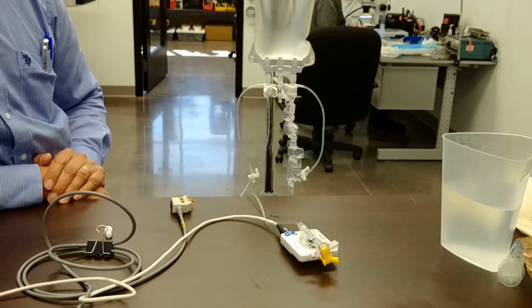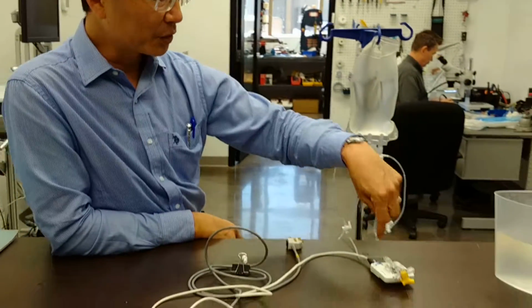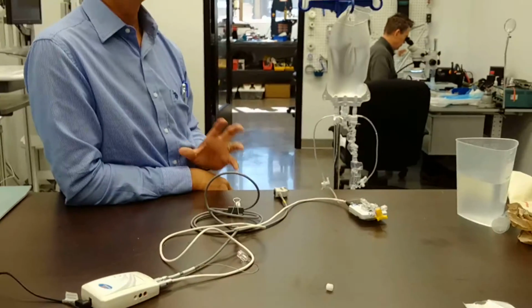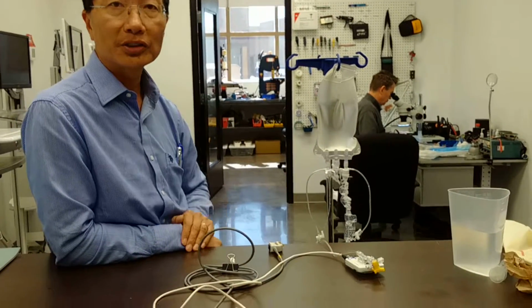Okay? The only disadvantage, I guess, in this kind of a dual monitoring configuration is that you can't monitor the bladder pressure of the water during the pumping phase, because when you pump fluid through the transducer, we know that the pressures will spike straight up, and that's fine. So if you want to check your catheter position, you want to check your transducer integrity, just stop filling, the two numbers should be the same, and just keep on going with your test.